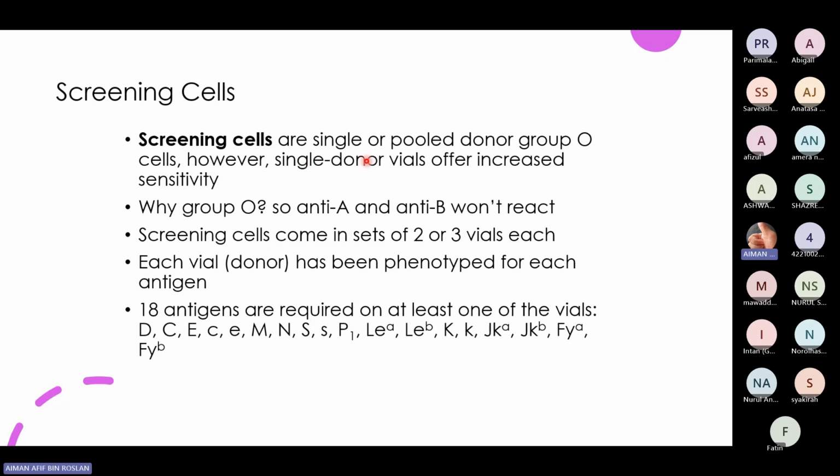Screening cells are single or pooled donor group O cells. However, single donor cells offer increased sensitivity. Why use screening cells of group O? So anti-A and anti-B won't react. Patient serum kita akan react dengan cells group O lah. Kita pakai serum of the patient.